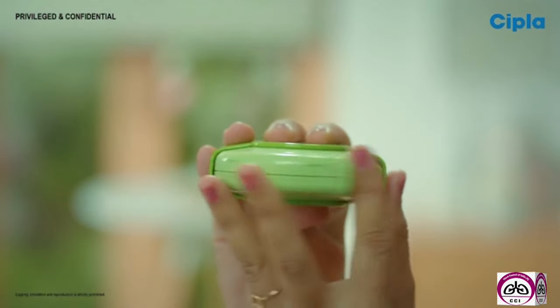To close the SipHaler, put your thumb on the thumb grip and slide the thumb grip towards you till you hear a click sound. This makes your SipHaler ready to use again the next time. After inhalation, always remember to rinse your mouth with water and spit it out. Make sure you don't swallow it. And if another dose is required, repeat the same steps.